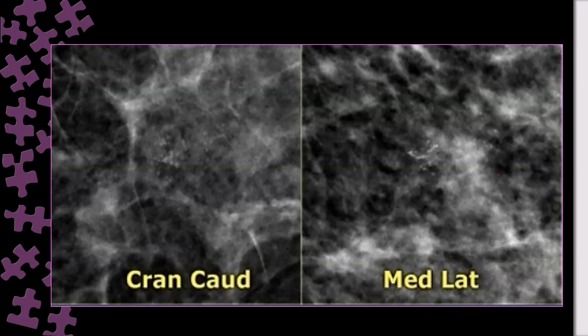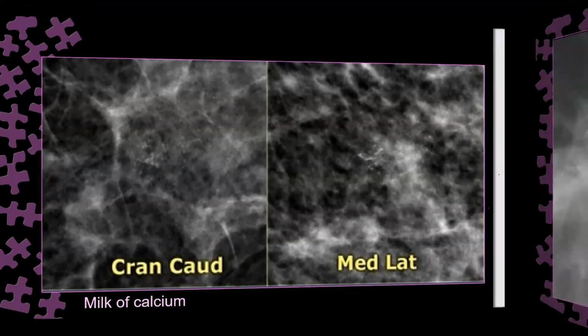And don't be hesitant or confused. Make sure, because every day you will see at least 5 to 7 ladies from 10 having fibrocystic changes. And this is one of the features of fibrocystic changes seen on mammography. Okay, this is the milk of calcium. That is why I've shown it to you.